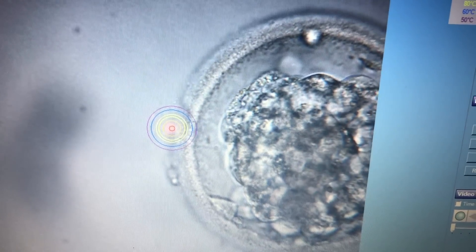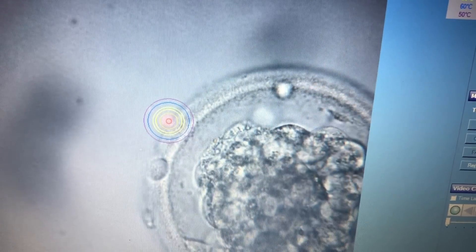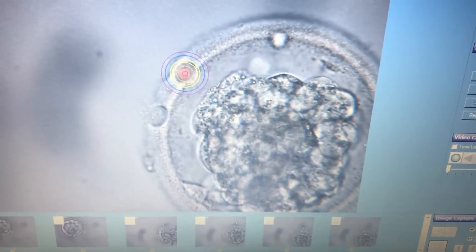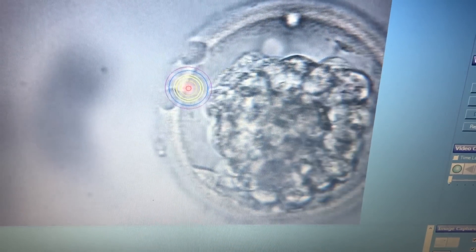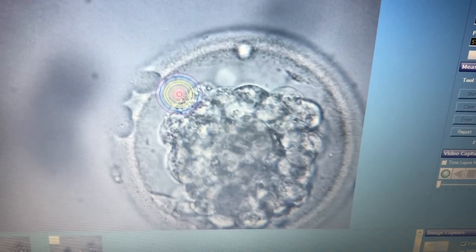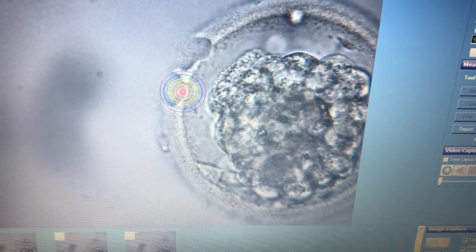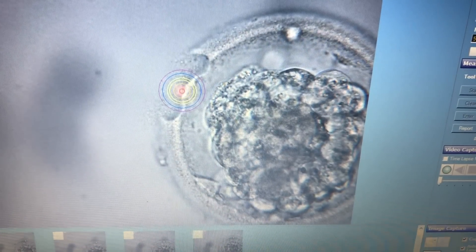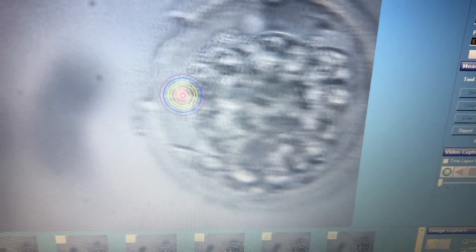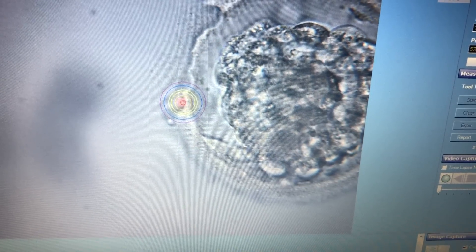The second embryo is slightly shrunken. This is an embryo which is being hatched immediately post thawing, and this is the most effective time to perform laser-assisted hatching. The firing of the pulses is slightly easier because the embryo is currently shrunken, as a result of which the sodium channels in the embryo cells are not active and hence absorption of the media does not occur to regenerate the blastocoel cavity.